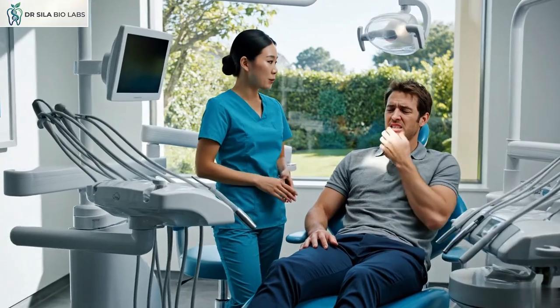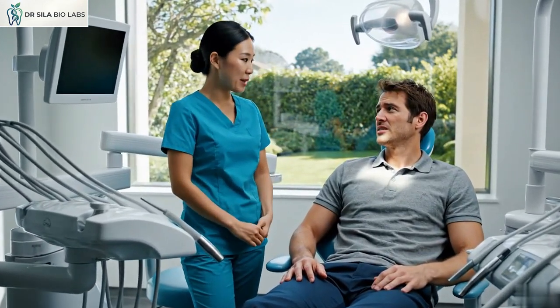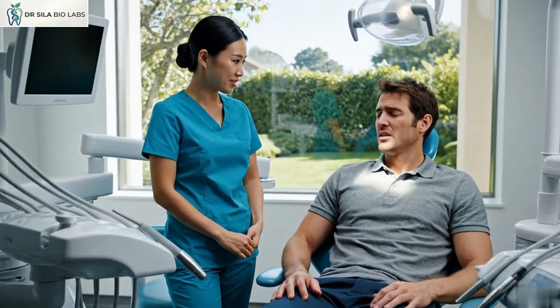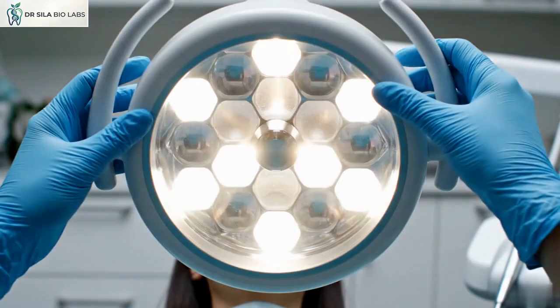I know you're in a lot of pain right now, but we're gonna take great care of you. We'll start by examining the area around this tooth. When a patient presents with symptoms of a tooth abscess, a thorough dental examination is the first step toward diagnosis. The dentist begins by carefully examining the affected tooth and surrounding tissues.